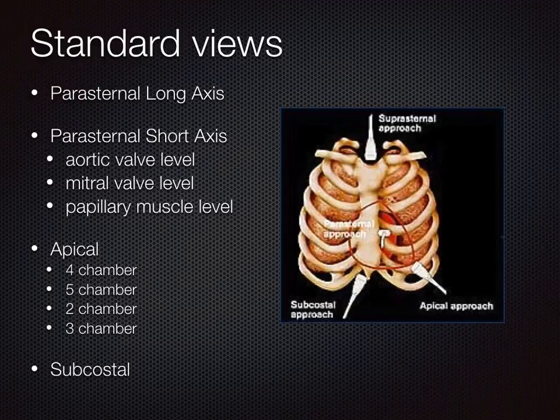So really the way we have to look at these windows of the heart is to often go through or under where ribs are, and that's why we use quite a small probe footprint, and this is able to look through and see the heart hiding behind the sternum and in the rib cage. And often as well it can be difficult to see because there is aerated lung. And remember, when there's air around, it causes big reflection when it's next to soft tissues.